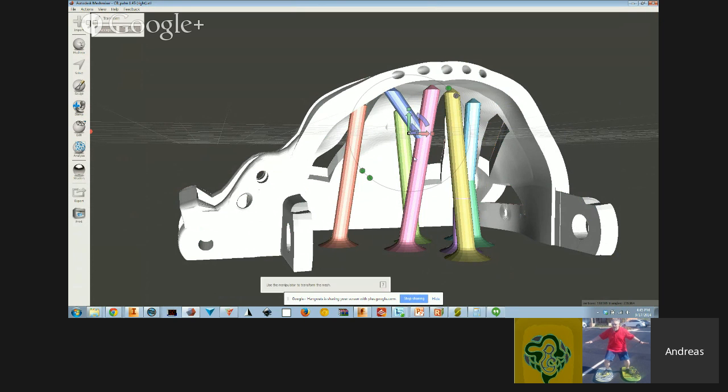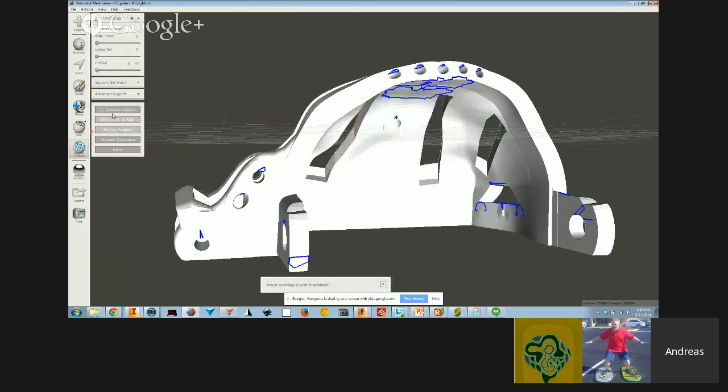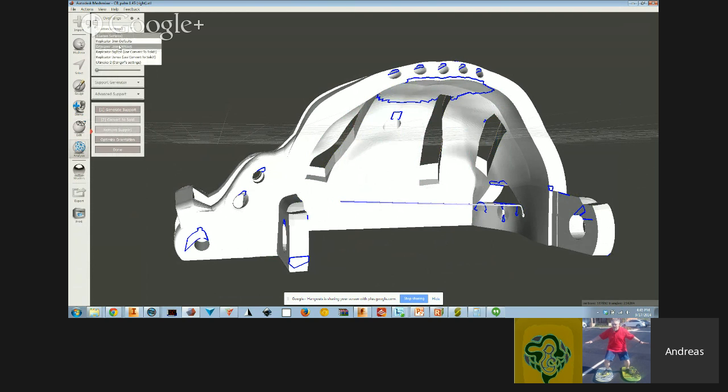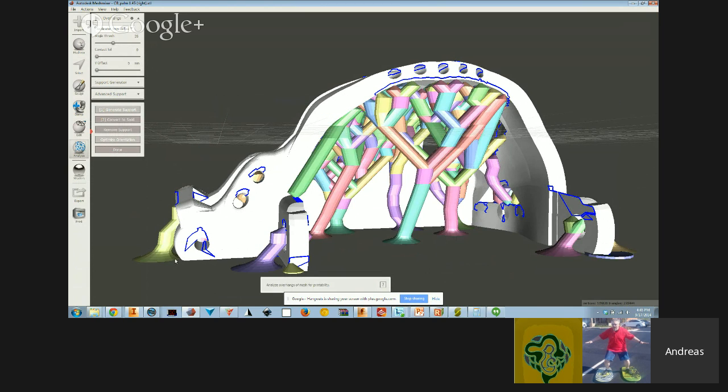If I go in here, let's do a quick move of this thing. So here: analysis, overhangs, remove support, generate support. Let's say this is the support I wanted. Oh, there's nothing there. Let's do the 3mm defaults, and we'll just pretend to generate. Okay, pruning, optimizing. Then I'll end on this little point here to finish off this thing. Again, I can come in here and get rid of stuff if I need to, just control clicking on stuff. I can do that on the other side as well.